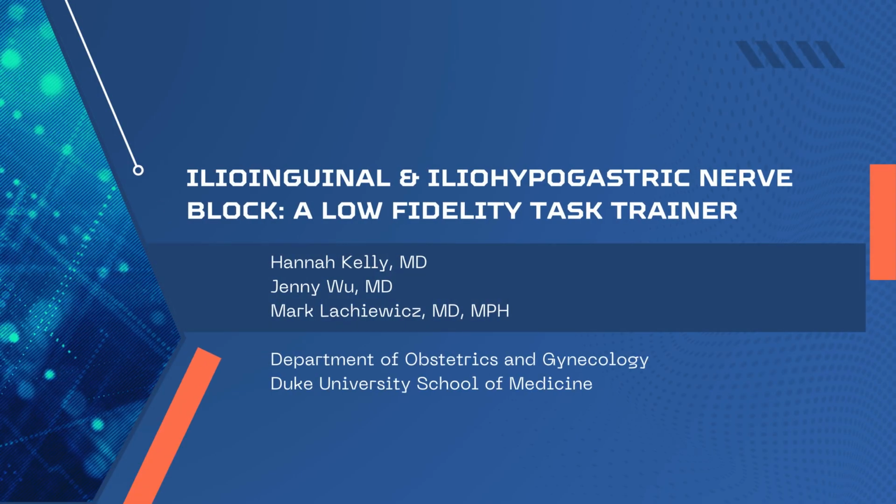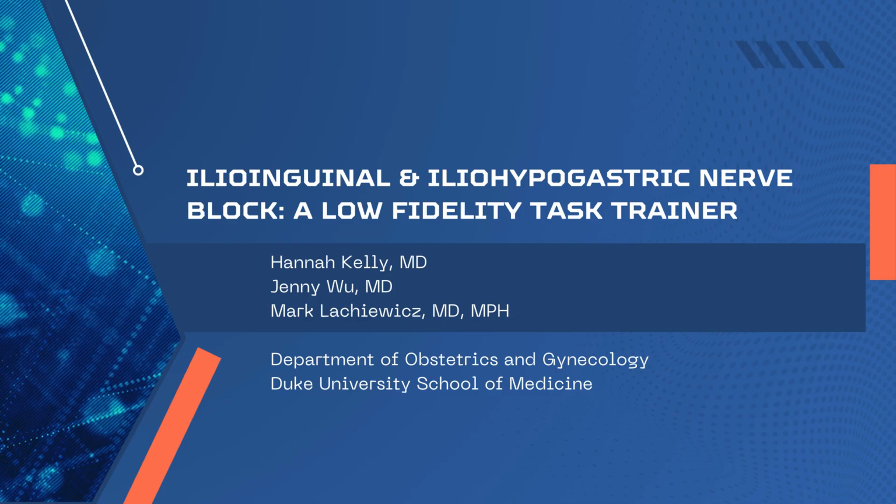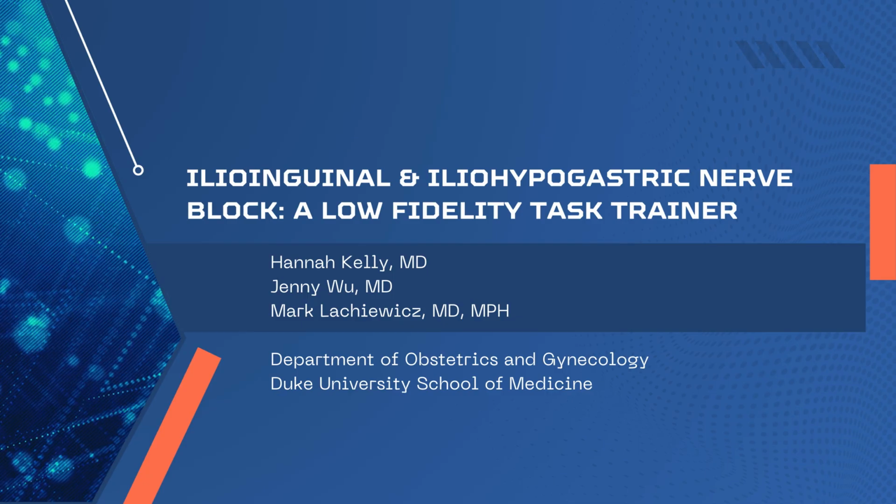Ilioinguinal and iliohypogastric nerve blocks, a low-fidelity task trainer. In this video, we will guide you through building a model that demonstrates the technique for performing this procedure.